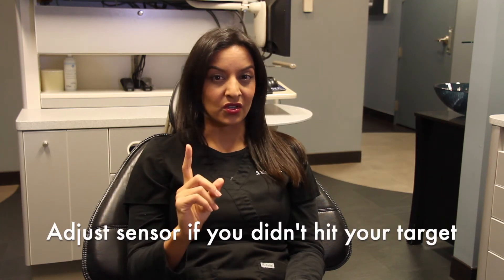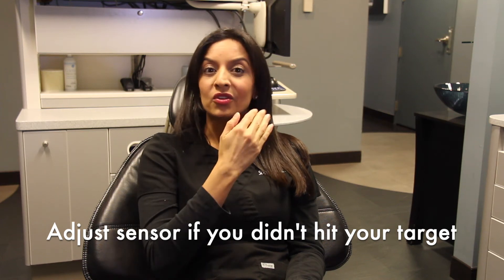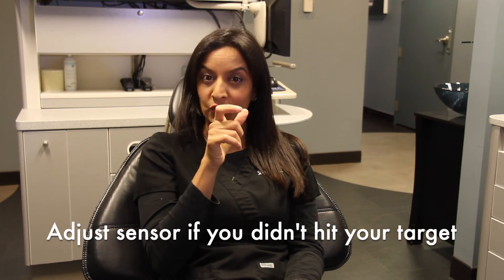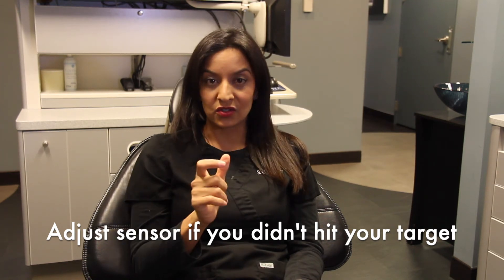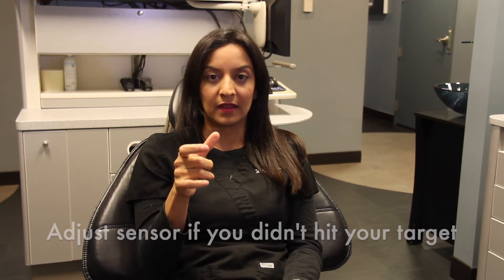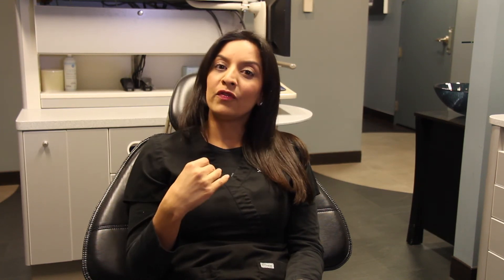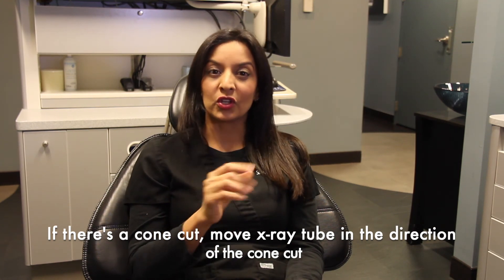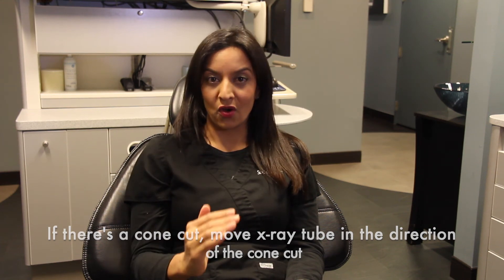If you want to troubleshoot any x-ray, there are really only two things you can fix: your sensor or the angulation of your tube head. If you've cut off your apex, always adjust your sensor. If you are too distal when you meant to go mesial, adjust the sensor. If you didn't grab the tooth in your picture at all, adjust the sensor in the area you need. If you have a cone cut, change your tube head angulation and move the tube head into the direction of the cone cut.